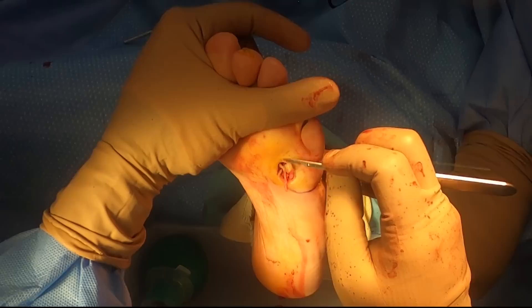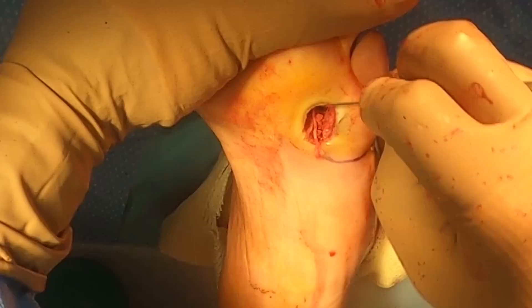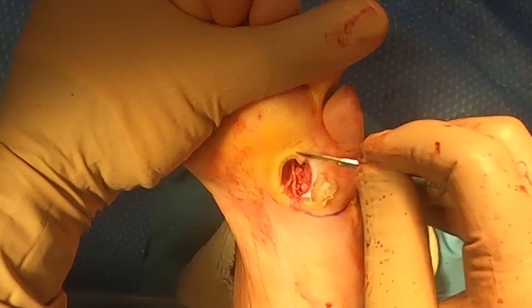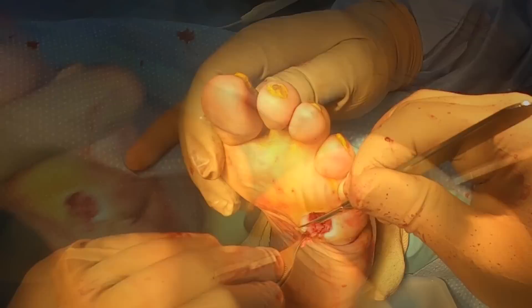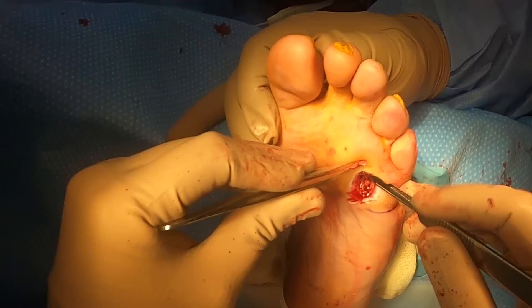Now we've got this wound and I needed to debride it down. Because if I don't get good bleeding edges around that wound, it's going to be very, very difficult for this to heal. I want good, healthy bleeding tissue around this wound that I've actually deepened and debrided out even further. I'm removing all the dead, non-bleeding tissue down to those bleeding edges.